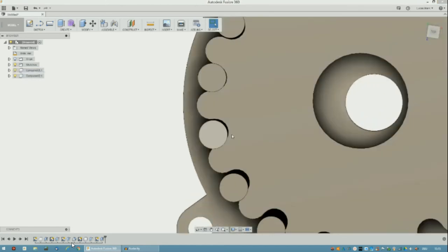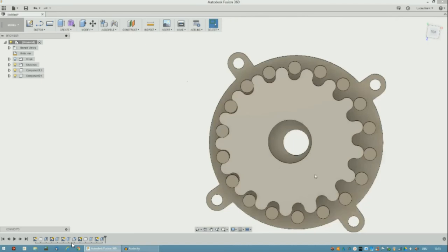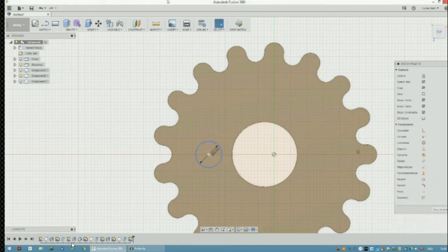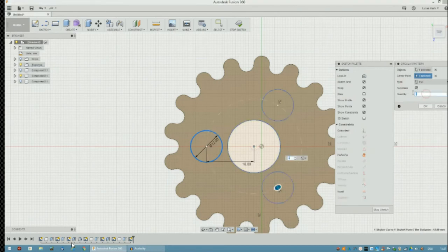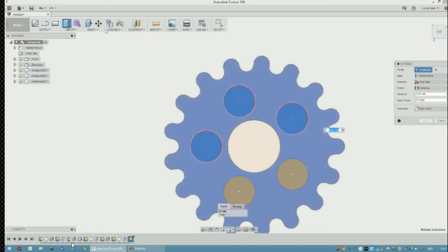And that's basically it. Now you need to make the cam, the shafts, all this stuff, but you also need this. This is the part which will take the force out of it, the transmission to the next stage or to the final arm. It will take the wibble wobble out of it. So here you take a rather big diameter. I took 13 and also pattern it around 5 times, I think, and extrude that material away.